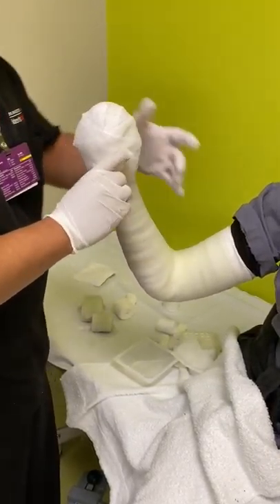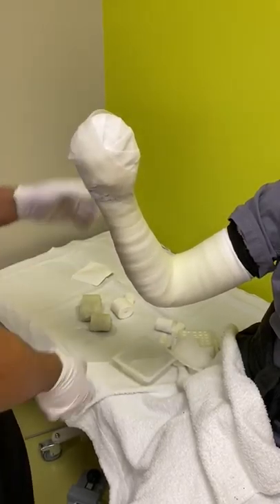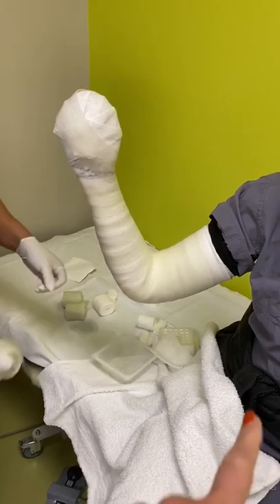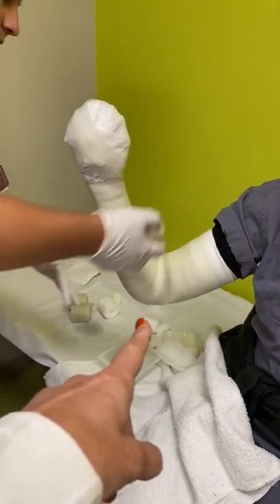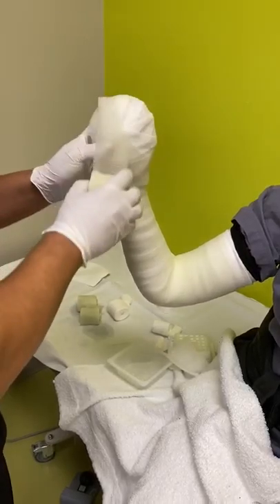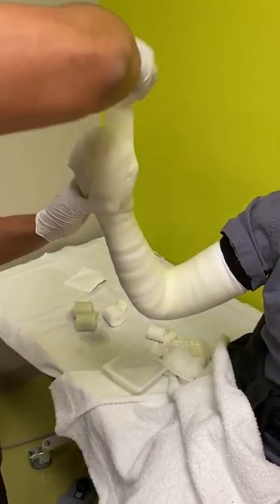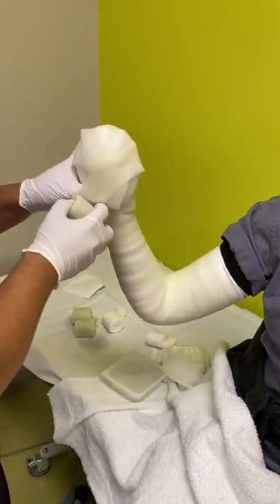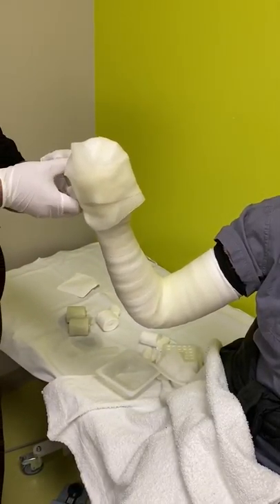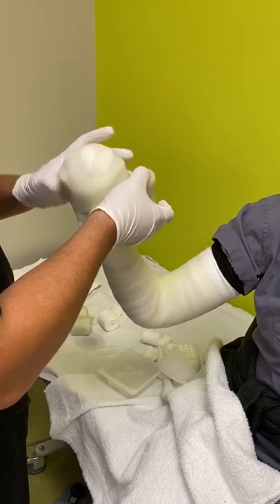Ray is going up with the fiberglass material at this point, starting at the upper arm and working his way up. When he gets to the mitten part, he'll start fanning the cast material back and forth, making sure that there's plenty of coverage around the club of the mitten cast.